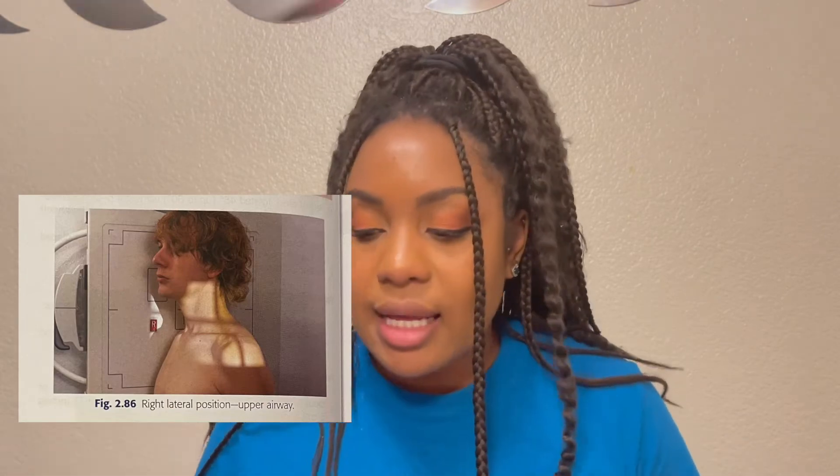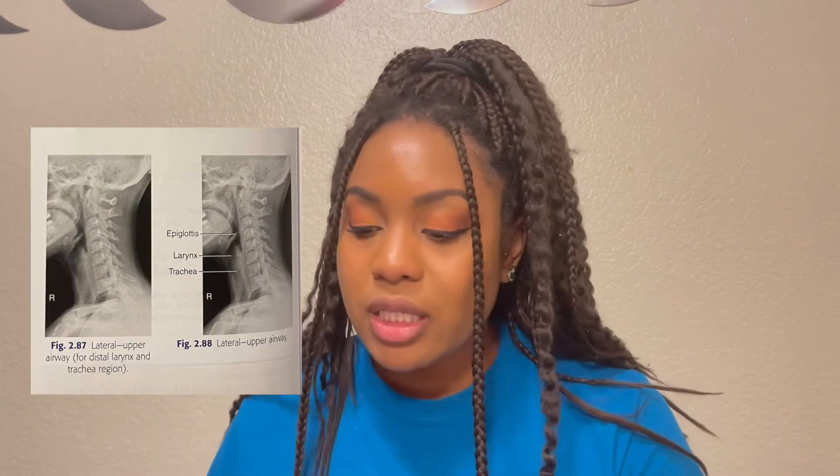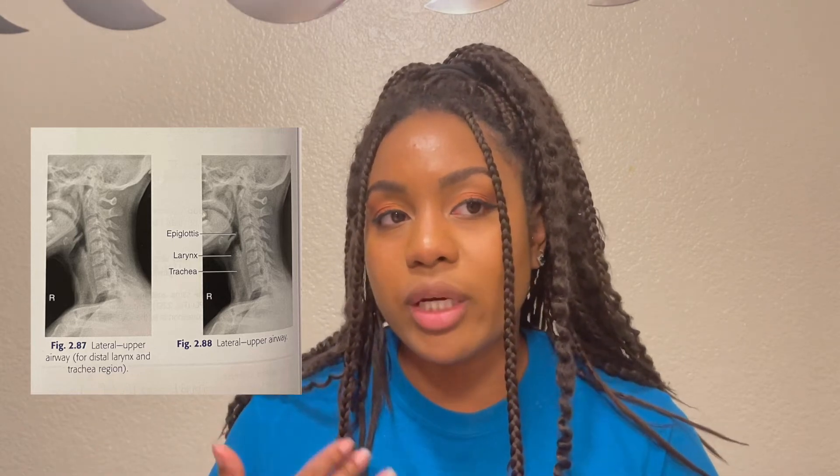For the lateral position, have the patient with either the left or right shoulder against the IR. Rotate shoulders posteriorly with arms hanging down. Raise the chin slightly and have the patient looking directly ahead. The exposure is made at a slow deep inspiration to ensure that there is air in the trachea and larynx.